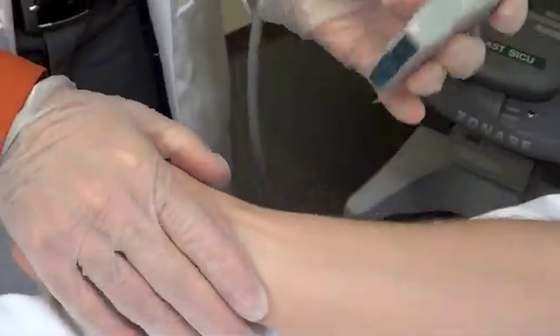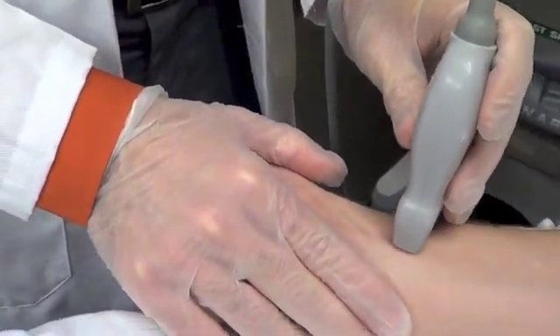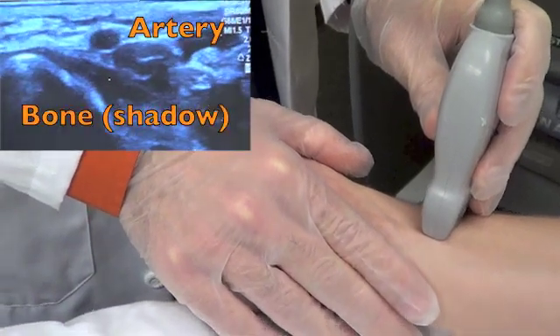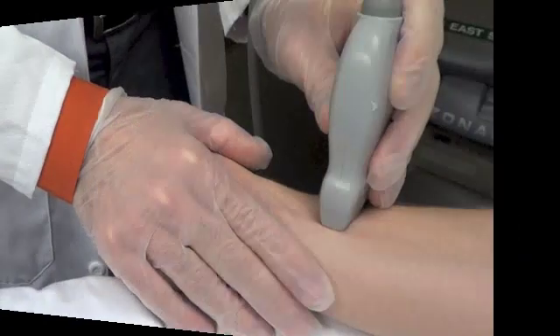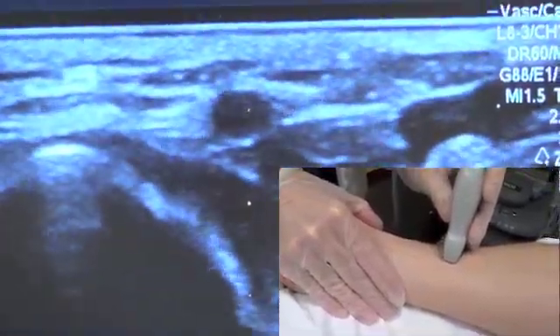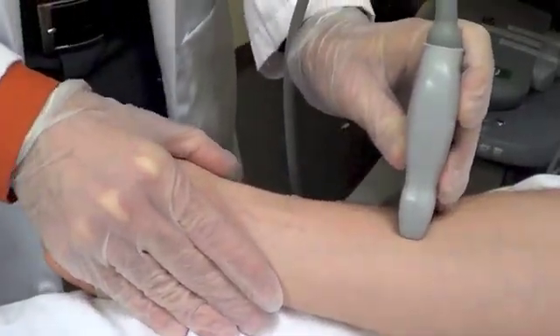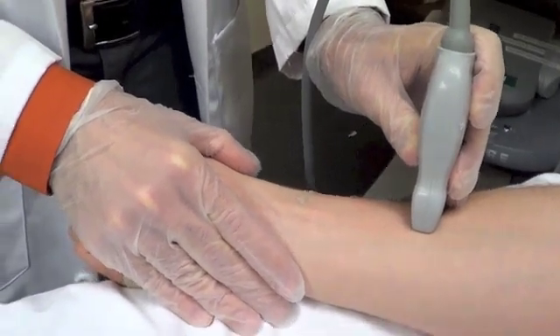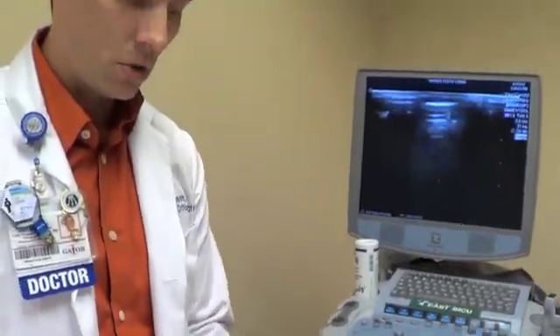I'm going to place the probe in a transverse fashion directly over what I feel to be the radial artery. In this case, I'm able to see it almost immediately on the ultrasound monitor. Now in order to ensure that I'm in the best spot, I'm going to slide proximal or slide up on the patient. It's important to note that I tend to go much more proximal on the patient.